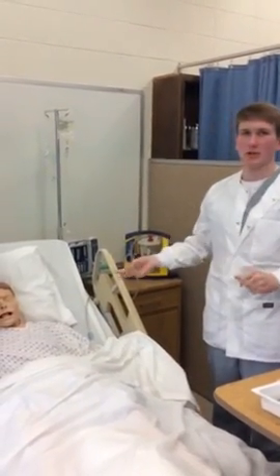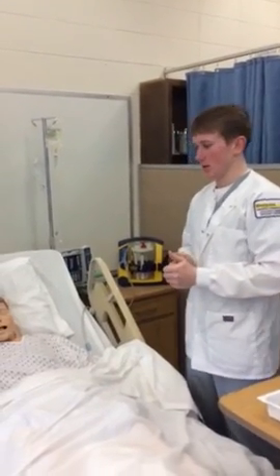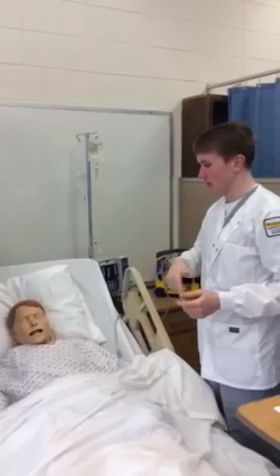And then assess the patient's mental status, so I'm going to test their person, place, and time, and explain the procedure to the patient. So we'll be sticking the NG tube up through the nares to the back of the throat, called the pharynx, and then all the way down to the stomach.